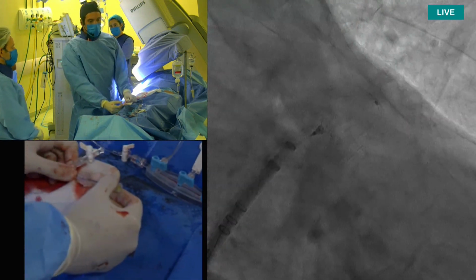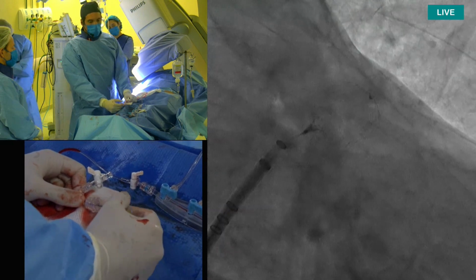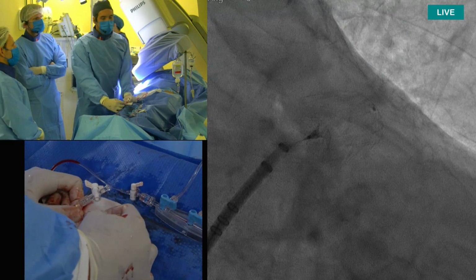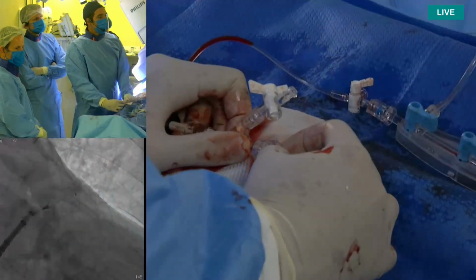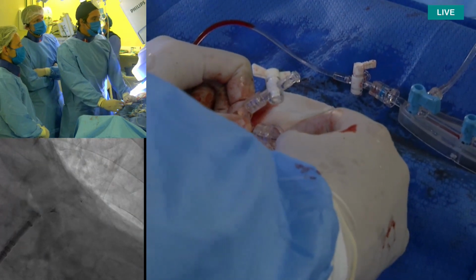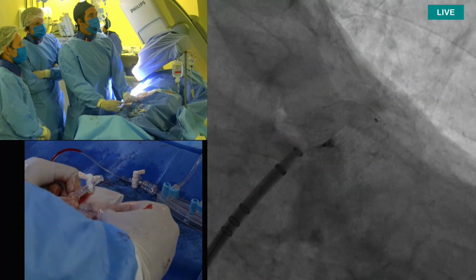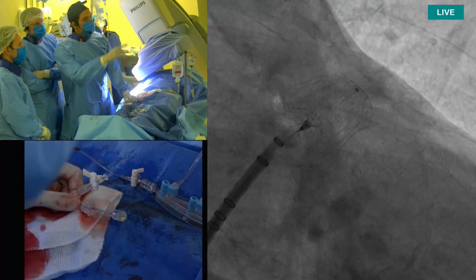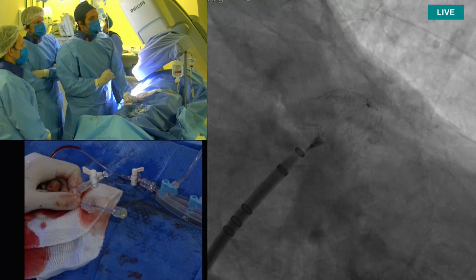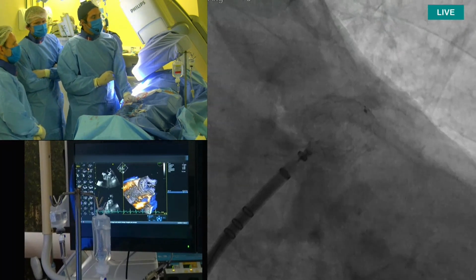Okay, so what we are going to do, this is the movement. I'm going to be pulling the knob, okay? So the screen please, so we can have the echo image of the tug test, also the angle. I mean the fluoro. Okay, so this is pretty much what we have. This is a fine tug test. What we're looking for, we can see the distal marker of the device. The way that it comes back, it has to go back to the last position. So we know the tug test is okay.